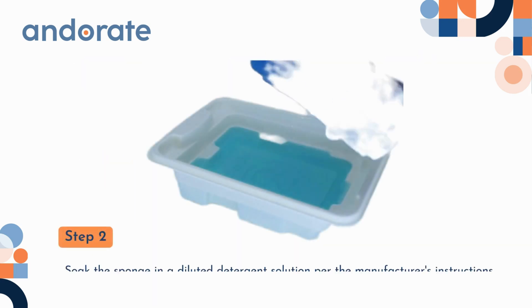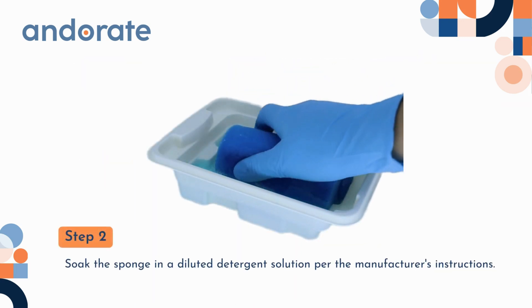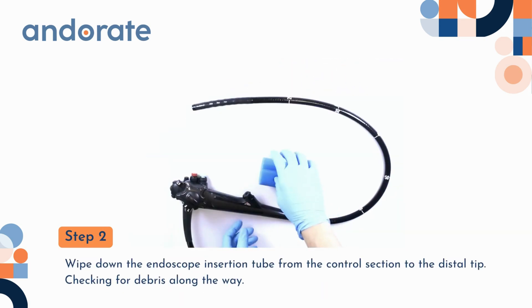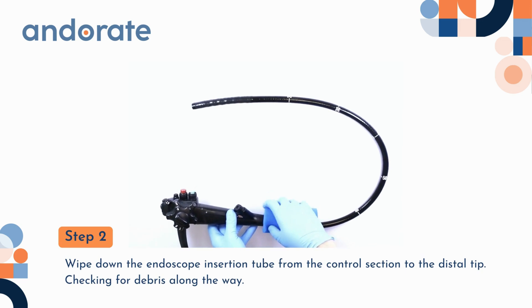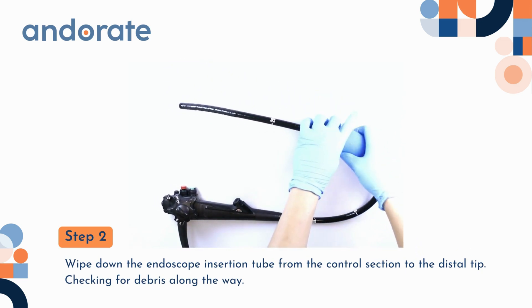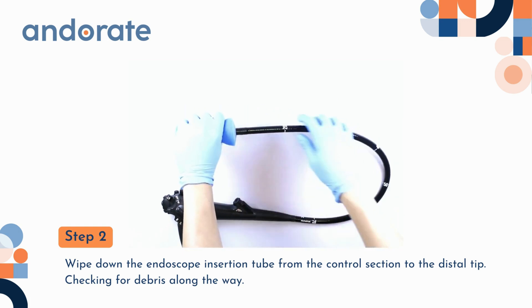Step 2. Soak the sponge in diluted detergent solution per the manufacturer's instructions. Wipe down the endoscope insertion tube from the control section to the distal tip, checking for debris along the way.